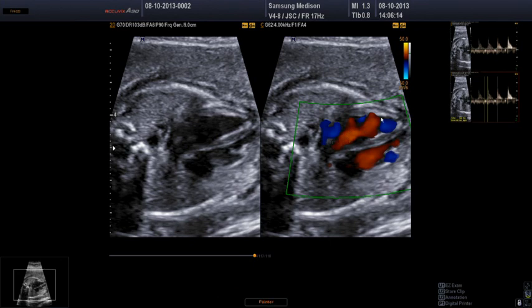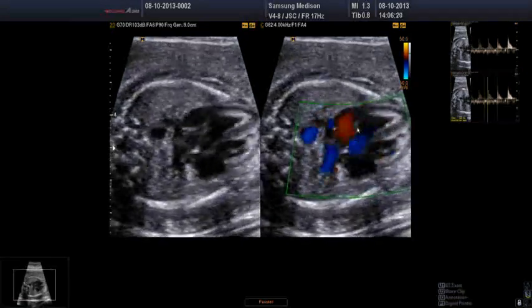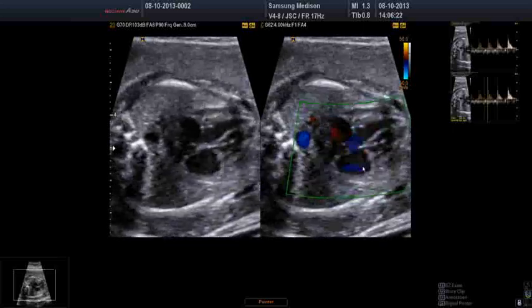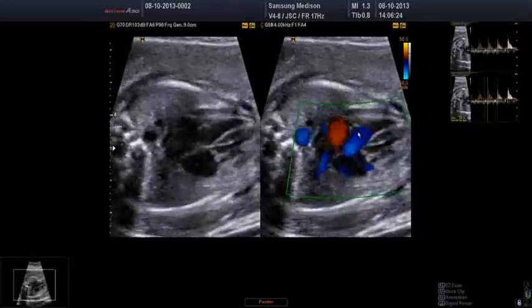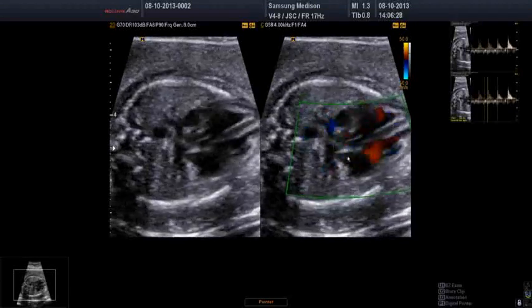So you see that in the normal heart, the aorta will come here, wedged in between the mitral valve and the tricuspid valve. So you can easily, if you want to get Dopplers, inflow and outflow of the aorta, you can easily get it here.